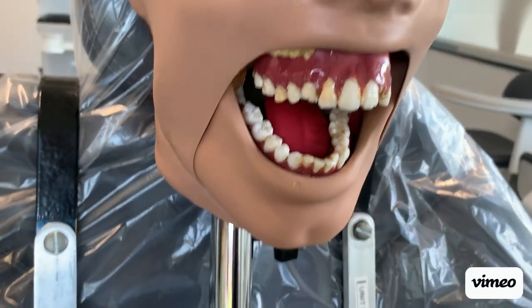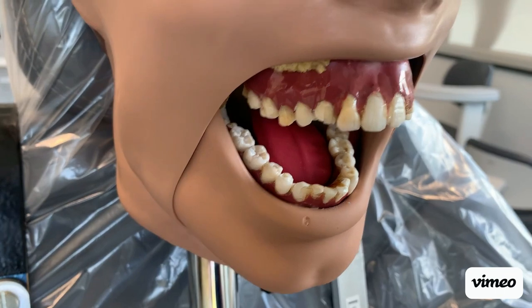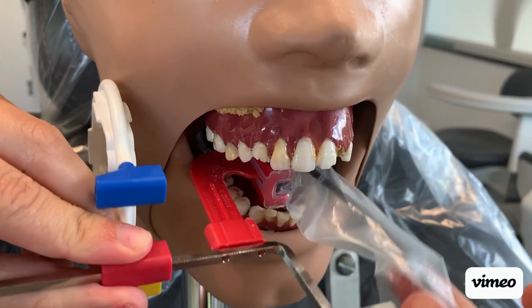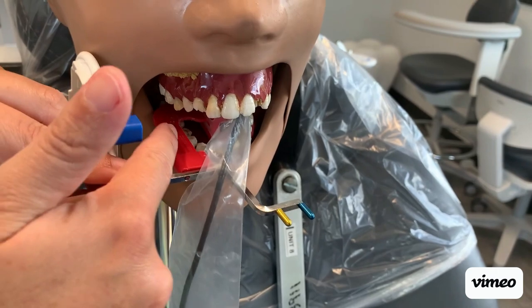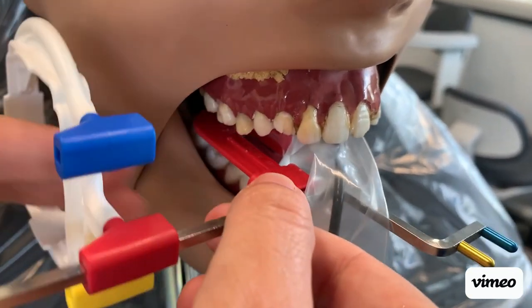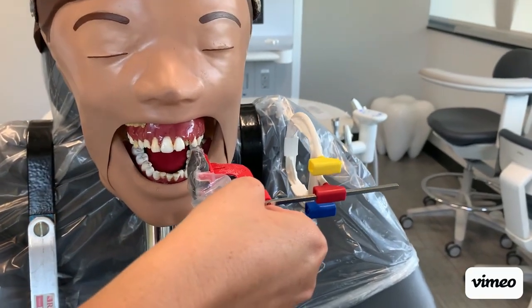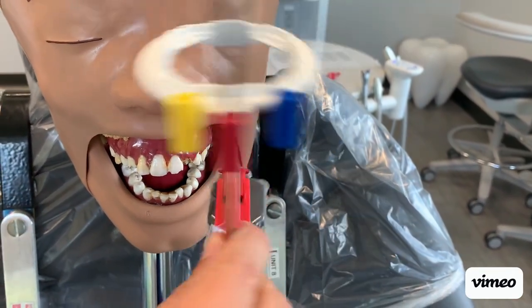For your bite wing images, we'll start with the molar. Slide the receptor into the patient's mouth — just like with your periapicals, you'll have the cord and bar coming out of the mouth, and then your ring. When you go to the other side, all you have to do is flip it. You do not have to change any of your setup — it works the same for all four bite wings, you just flip.